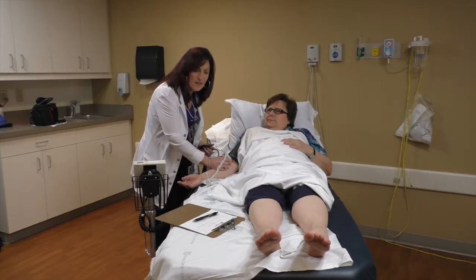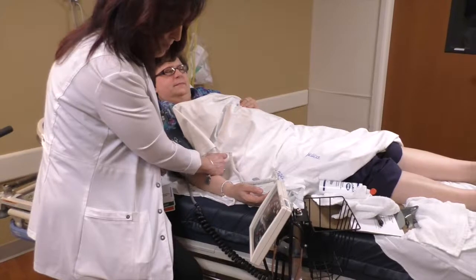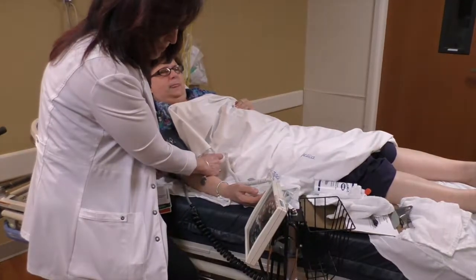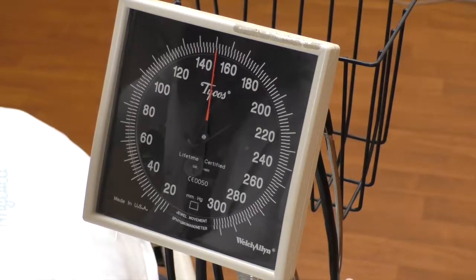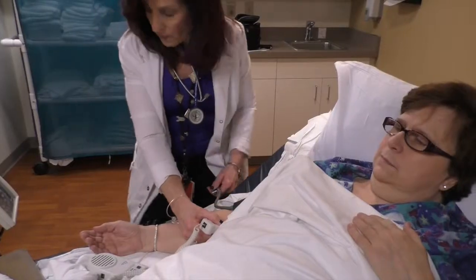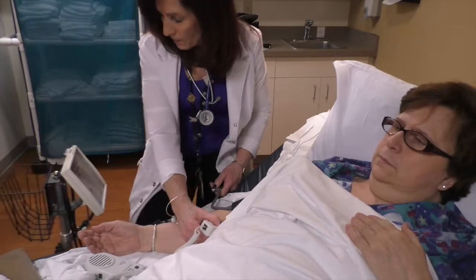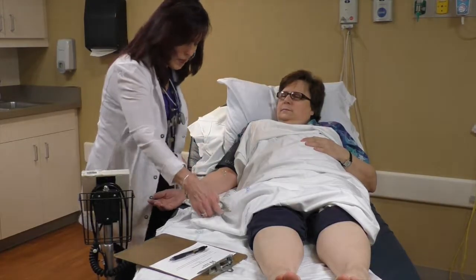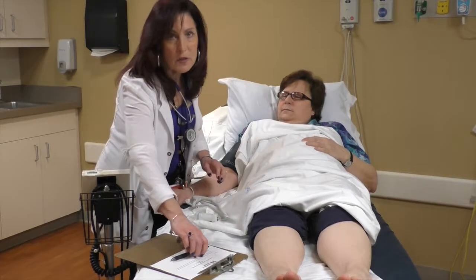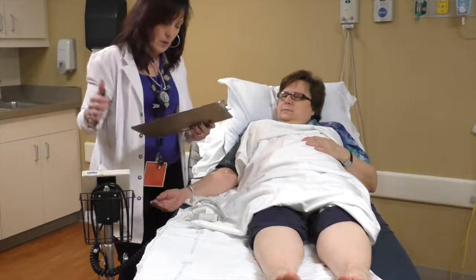That's a great signal. So now we'll take her blood pressure in her arm. You're actually just taking the measurement of her systolic blood pressure on her right arm.